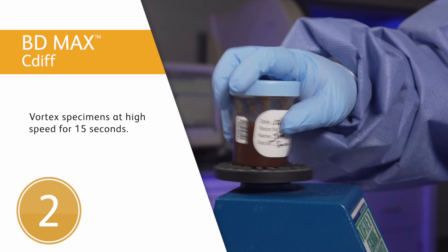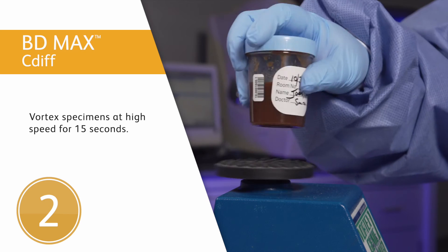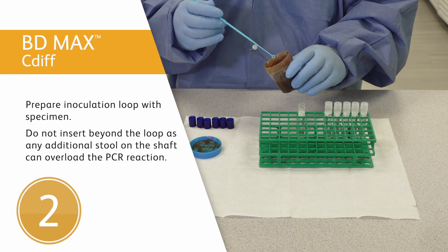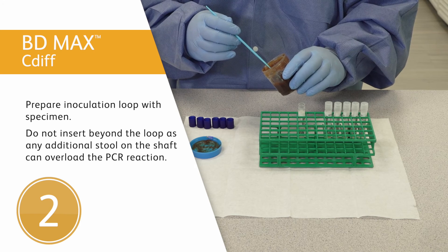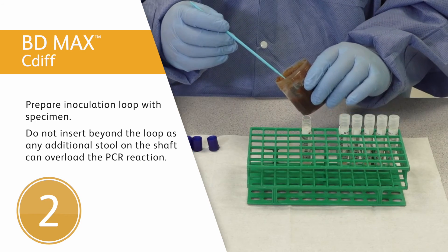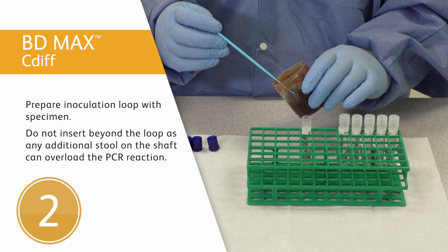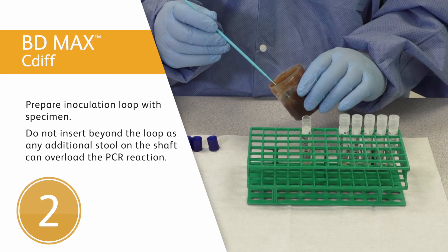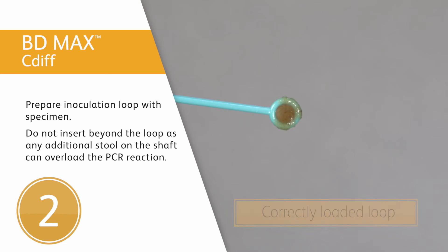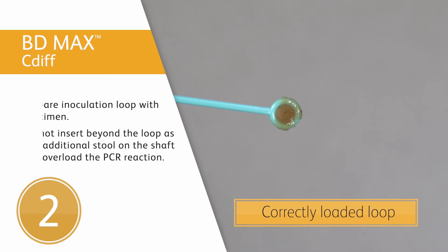Second step: vortex the specimen at high speed for 15 seconds. Insert a 10 microliter disposable inoculation loop until the entire loop portion is submerged in the specimen. Do not insert beyond the loop, as any additional stool on the shaft can overload the PCR reaction. For soft stool specimens, remove any excess stool present on the outside of the loop in order to obtain approximately 10 microliters.